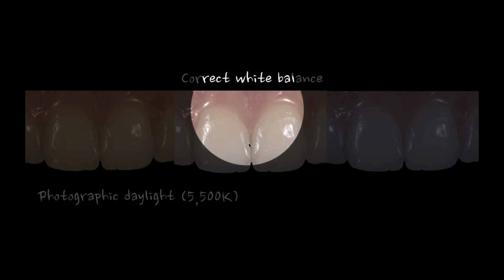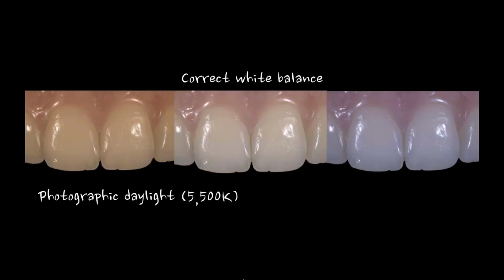By changing the settings that I just gave you, you're really just balancing out the lighting in the camera for dentistry. And this is why you do have to tweak your cameras a little bit to make them a little bit more useful for you.